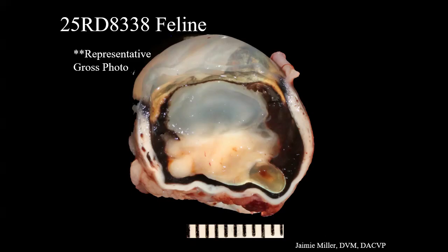But we did have at least one case of confirmed gastric carcinoma that metastasized to the eye. And that one had pretty impressive signet ring cells that we ended up with a PAS on, because it was the days where we got PAS and everything. It was beautifully positive secretory material in their cytoplasm.